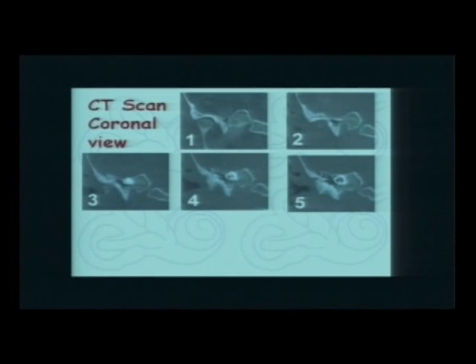You see these air cells inferior to the cochlea? This is the hypotympanic air cell tract. This is one of the most serious air cell tracts that can actually drive a cochlear implant surgeon into the wrong place. Why into the wrong place? Because they are going to think that this is the round window here, drill all the way here and put the electrode infracochlear. We have a term in Arabic which we call nadaha. I don't know if you know it or not.